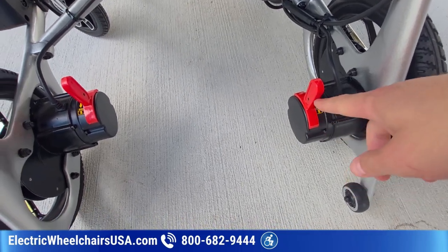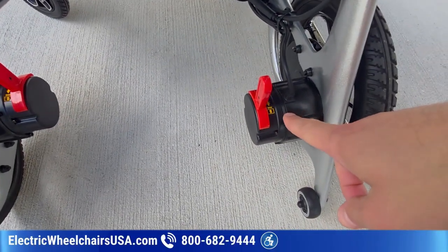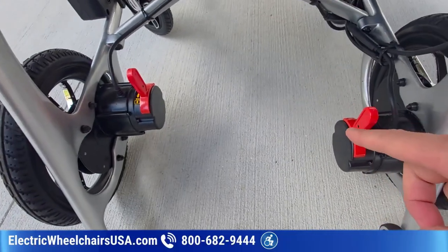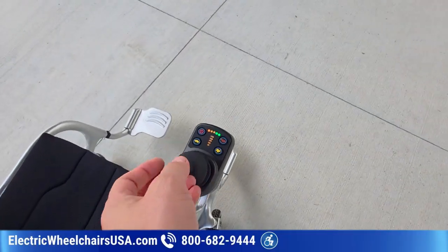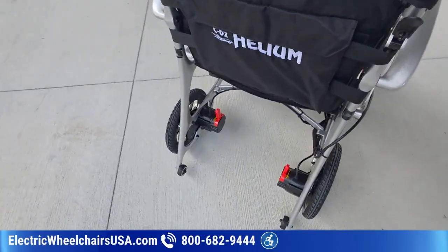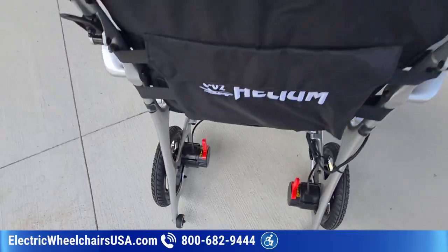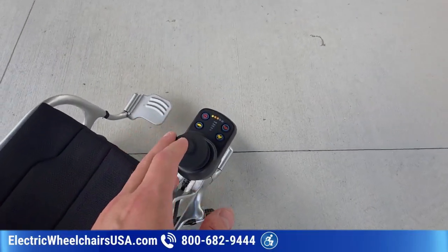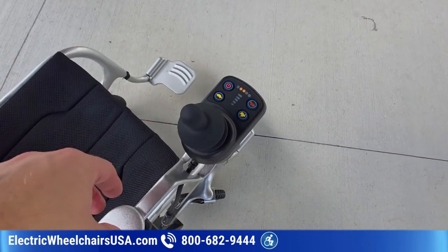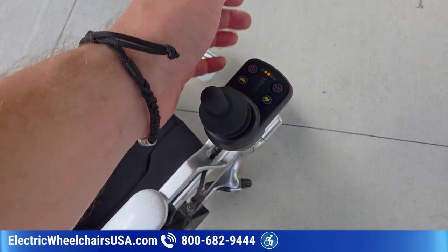Right now, both of these motors are in the drive position. When they're in the drive position, that's when you can use the electric wheelchair. So you accelerate with the joystick. When you let off the throttle, the electromagnetic brakes will automatically engage. But if you wanted to push it manually, like say you ran out of battery life, you would just push both of these levers forward. And now you can see you can't use the joystick, so it's not going to work because it's in neutral. It has to be in a drive position.